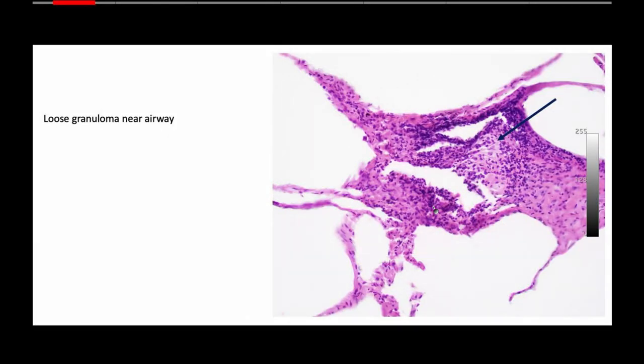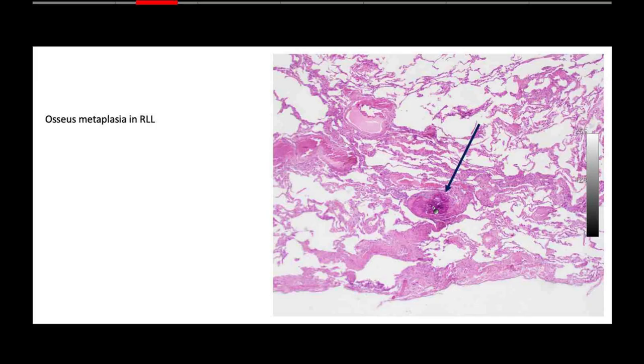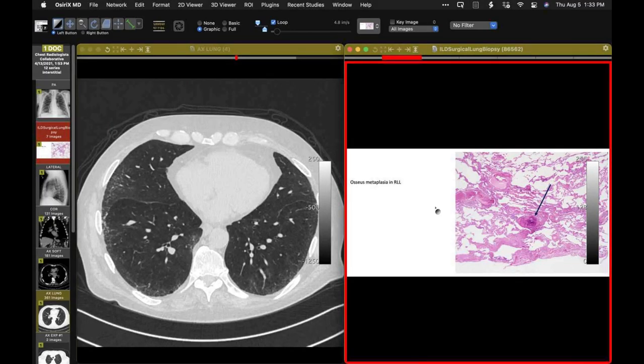So, what would one label this as? I don't know. If you have a granuloma and you have airway-centric disease, I think one would think of an inhalational disorder like hypersensitivity pneumonitis. Is this enough to describe this as a fibrotic HP? I don't really know. But I think this is fairly common. Sometimes you can have findings and not necessarily put it into a particular category.